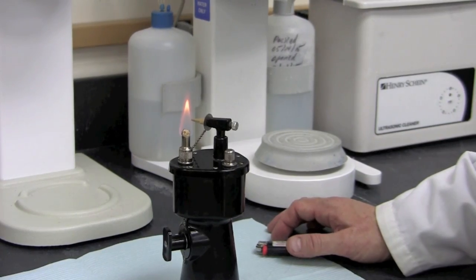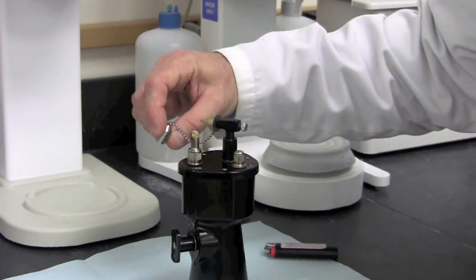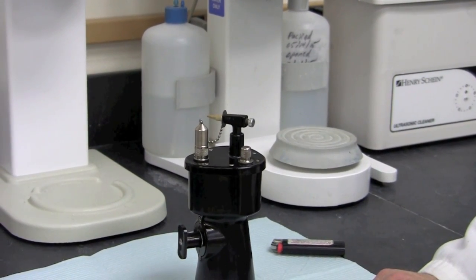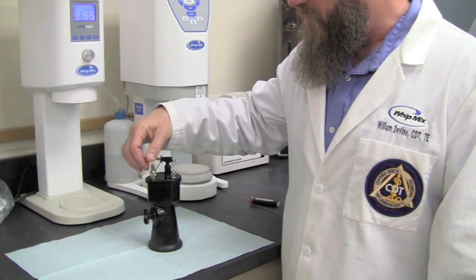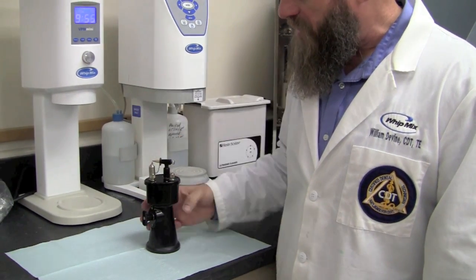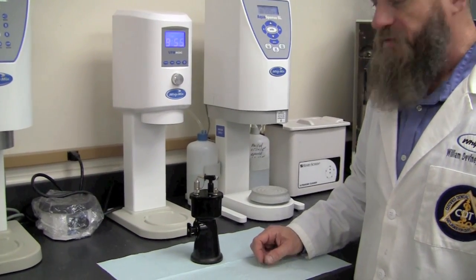To extinguish the flame, simply blow it out and use the wick cover to ensure complete extinguishing of the flame. When we're ready to store the unit, it's important to remove the wick cover and feel the wick to make sure that it's not warm to the touch. If it's not, simply put the wick cover back on and store it in an upright, safe fire cabinet.